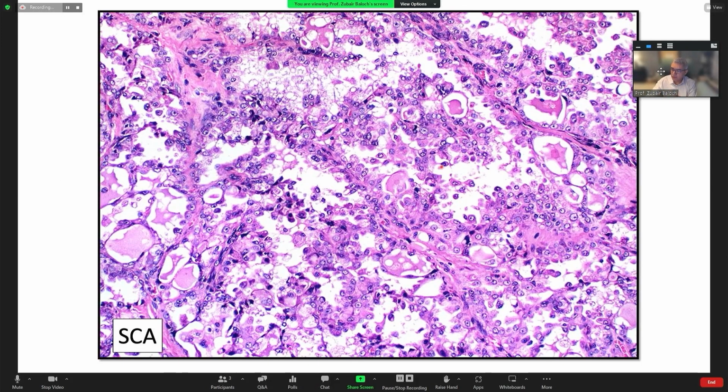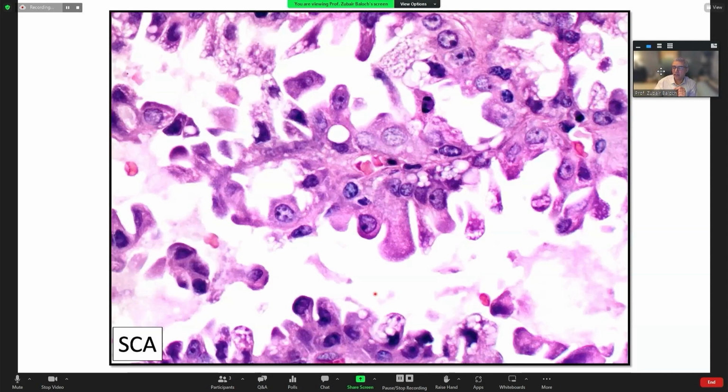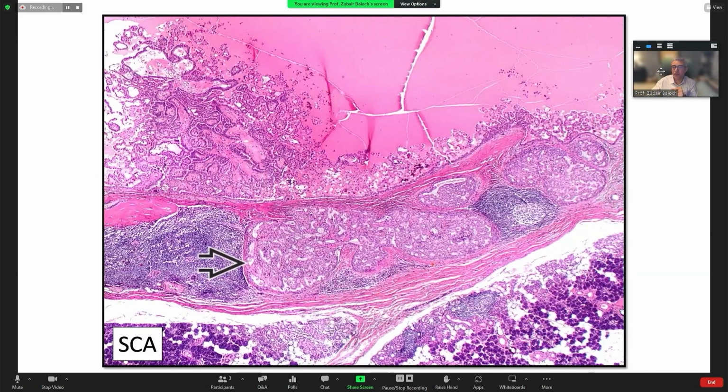They can have papillary grouping, with secretory vacuoles and mucin, and you can see this really bubbly cytoplasm, which actually shows up those gorgeous vacuoles on cytology. They can also be papillary and can mimic other tumors with a papillary growth pattern, as I showed you in acinic cell carcinoma. They can be cystic, so you can get a lot of mucin in the background and can mimic mucoepidermoid carcinomas. But the secretory vacuoles in the cytoplasm of the cell, not mucocytes or those glandular cells that you see in mucoepidermoid carcinoma, can lead you to think of this tumor in the differential.